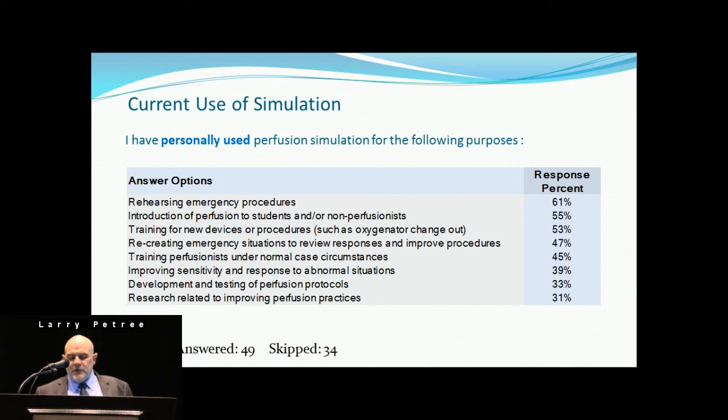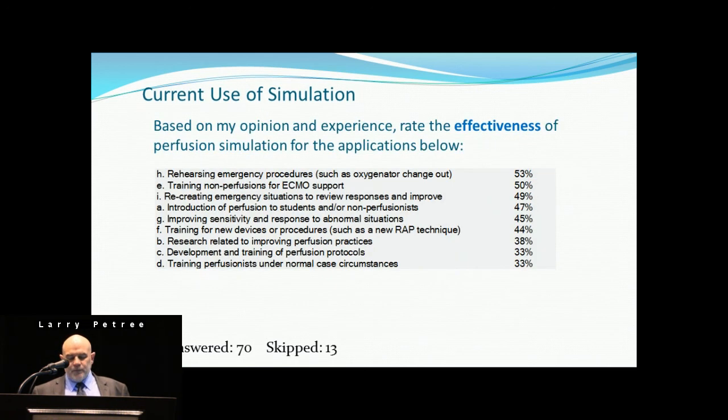Introduction of perfusion students or non-perfusionists came in at 55%. And that's a very valid application. Rather than watch one or come in and see an OR, have a seat at a pump and let's have you put the clamps in your hands and turn the knobs. And simulation can allow that. And then training on new devices or procedures. So if you're changing from one vendor to another, simulation is a great way to work out those bugs.